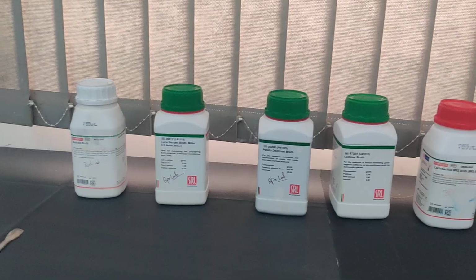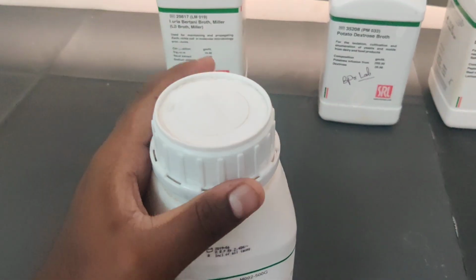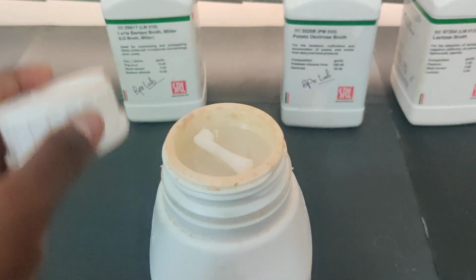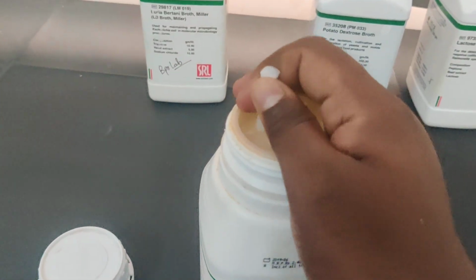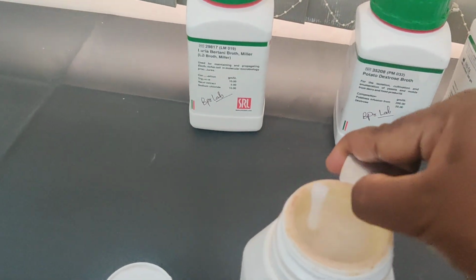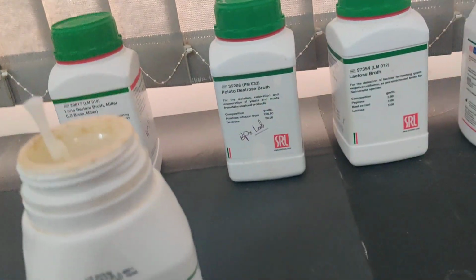So how to prepare this, that is what we are going to see now. Before that you have to understand how these mediums look, whether it will be in liquid form, powder form, or pellet form. So it has to be opened in a dry condition. You should not open it in a moisture condition, because even with a little moisture, it is highly hygroscopic in nature. Okay? Just a minute.